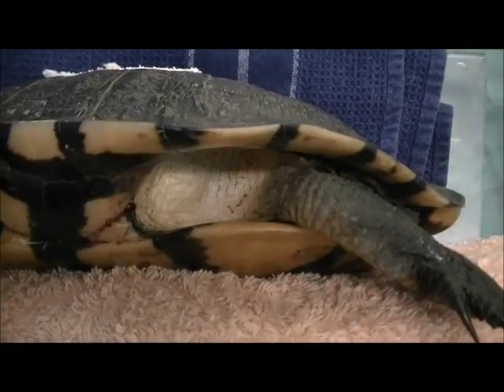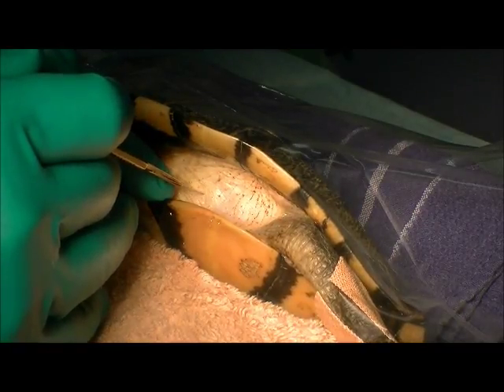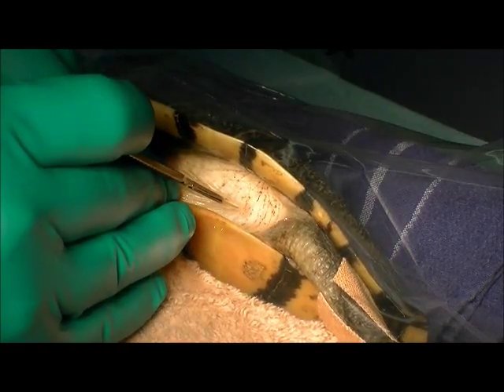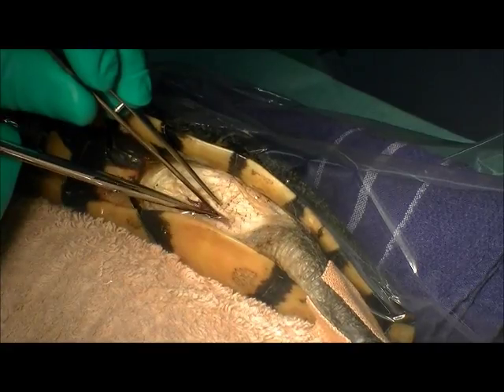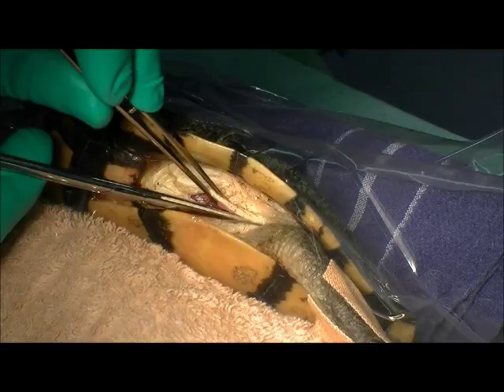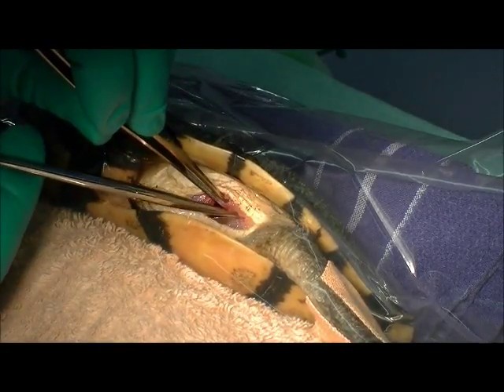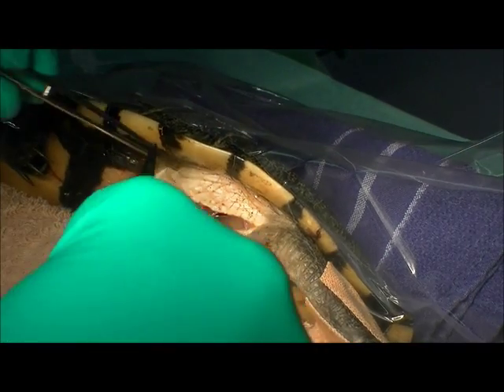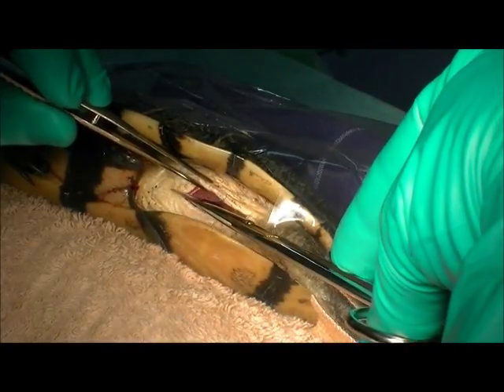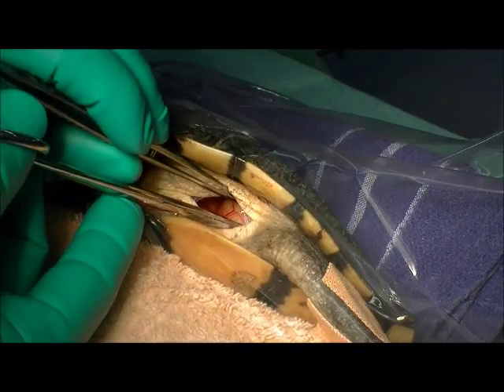She's got 16 eggs, so quite a number in there. We'll do our best to get them all out through the one incision. So we've got her prepped up and ready to go. We're going to make an incision down in this area, open up the belly cavity and get the eggs out — sounds pretty simple, we'll see how we go. It's quite a confined little space to work in. Just cutting through the muscle under the skin, and down through the hole I can actually see one of the eggs sitting there.